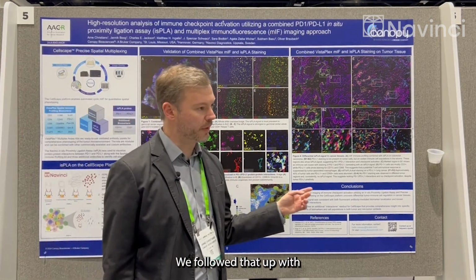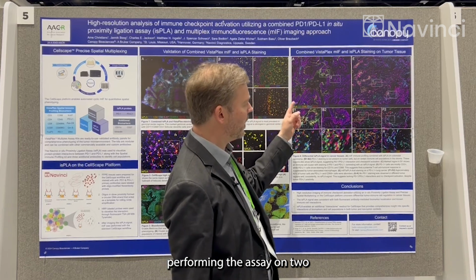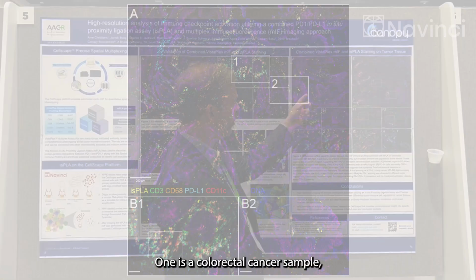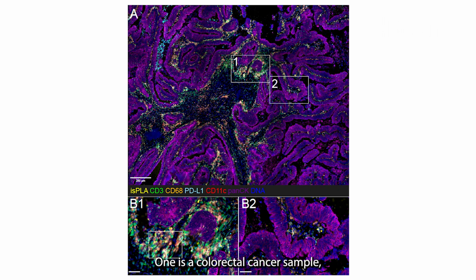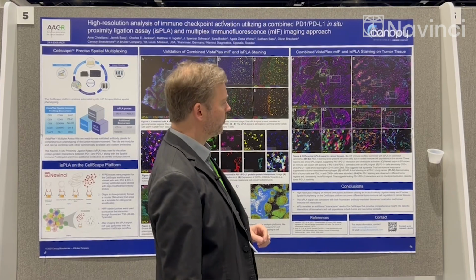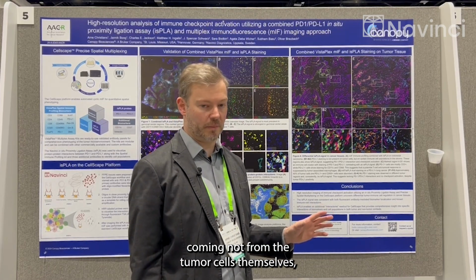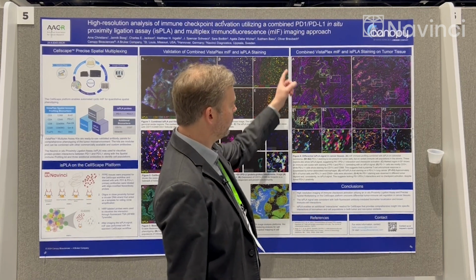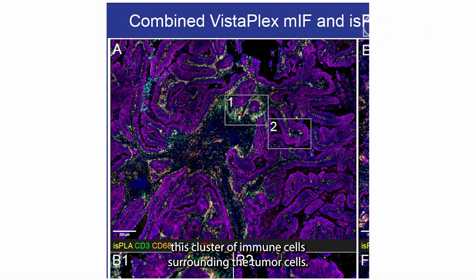We followed that up with performing the assay on two tumor samples. One is a colorectal cancer sample, and the tumor cells are actually completely negative for PD-L1. But we were still able to see PLA signal coming not from the tumor cells themselves, but from the tumor microenvironment. You can see this cluster of immune cells surrounding the tumor cells.